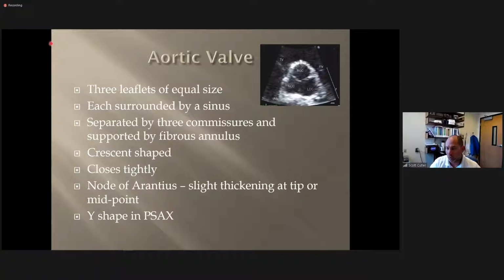One of the best things you can do in the world of ultrasound is trust your gut. When you're scanning and things just don't quite look right, maybe there's something going on. Maybe you should explore that more, which means you need to explore different windows and different perspectives to confirm whether things are in fact normal or not. So we've got those cusps all surrounded by a sinus.